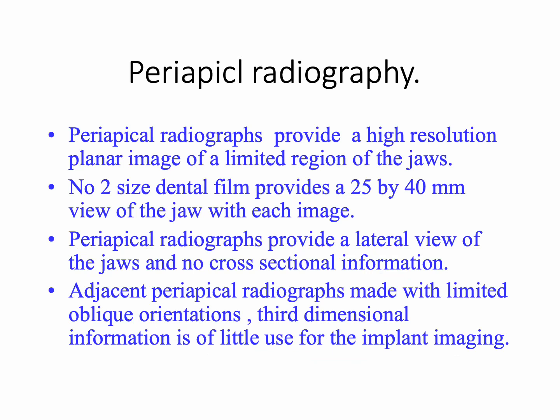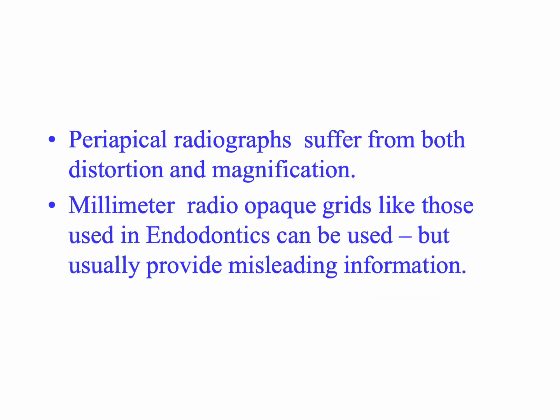Periapical radiographs provide high resolution planar imaging in a limited portion of the jaw, but the limitations are that it is a 2-dimensional image and does not provide 3-dimensional information, and is of little use while placing implants. Periapical radiographs suffer from both distortion and magnification.